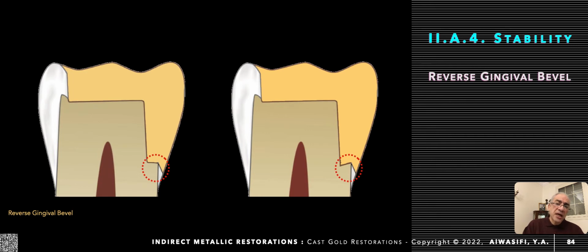Our enamel rods at this area are slanting to the outside. That's why we prepare it with a gingival marginal trimmer, to create the proper direction and the proper finishing of the enamel wall. The restoration, either direct or indirect, is not related to the technique; it is related to the direction of enamel rods. And this form is applied to all types of restoration.